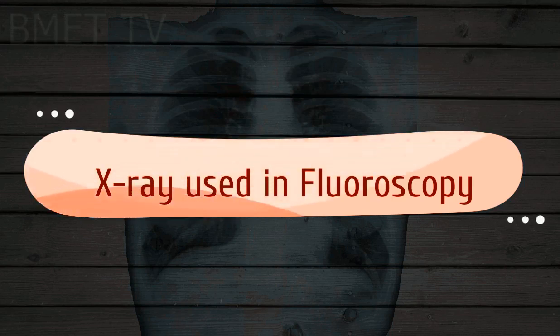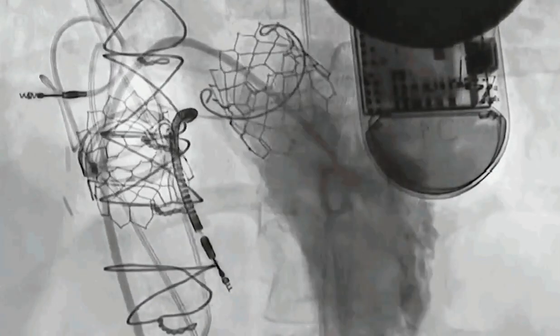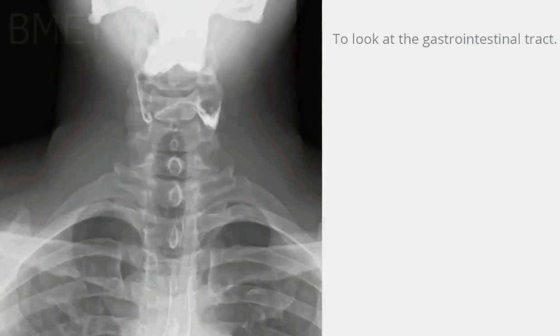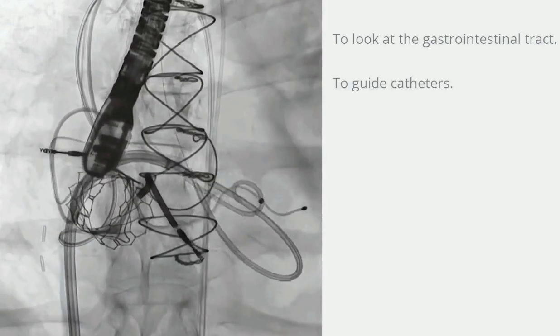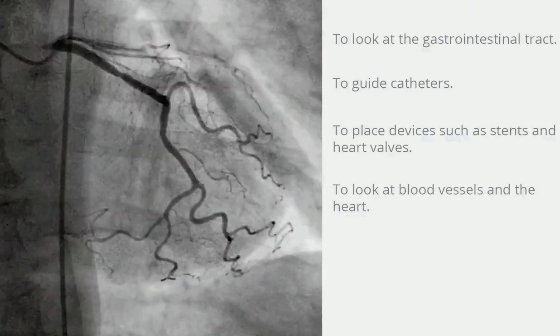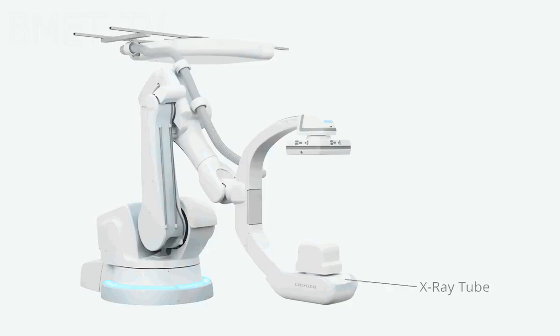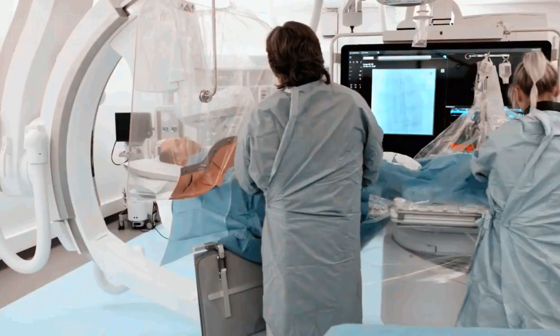Fluoroscopy. Fluoroscopy produces real-time images of continuous movement within the body shown on a fluorescent screen and recorded for analysis at a later time. It shows a live image of the patient's internal structures and can follow the path of an injected contrast substance. A fluoroscopy test depicts real-time images of a beating heart with the blood flow to the muscles of the heart. It is also used to position a pacemaker or catheter, orthopedic implants during a surgical procedure, or to view contrast agents. This is also the same technology used during a barium enema to view movement through the gastrointestinal tract.